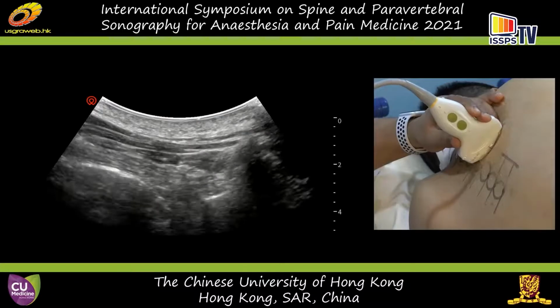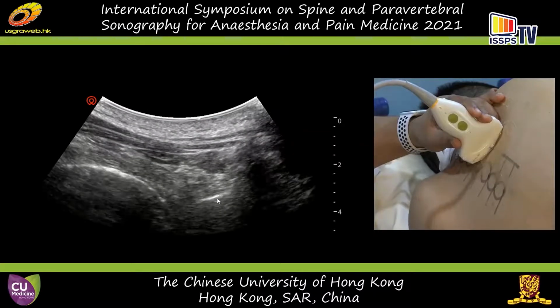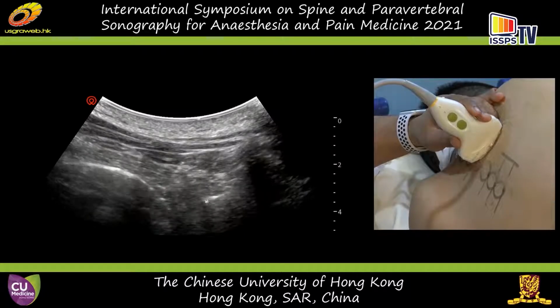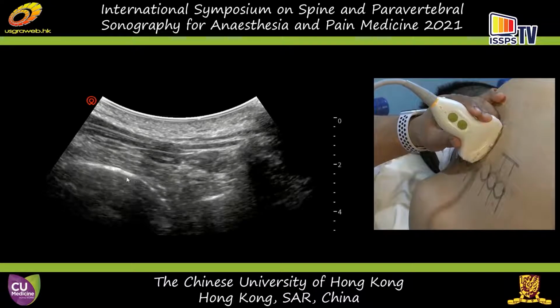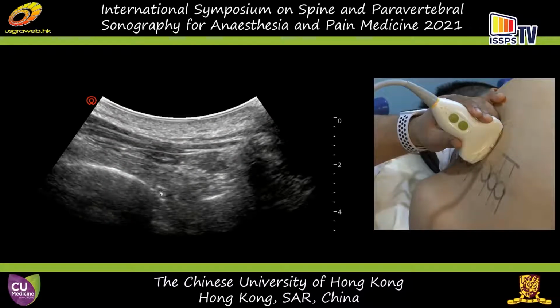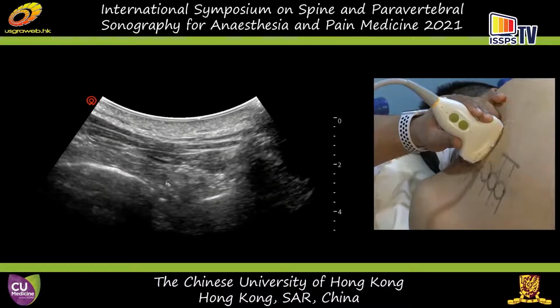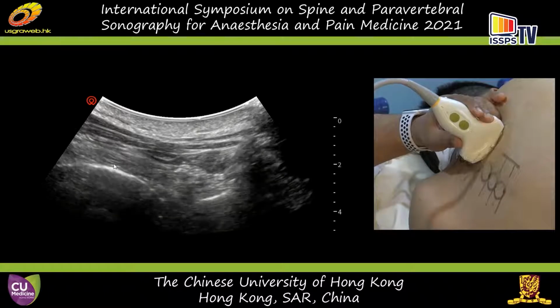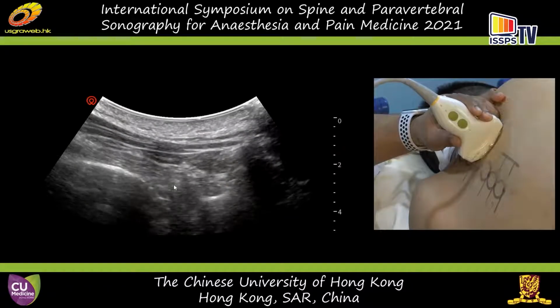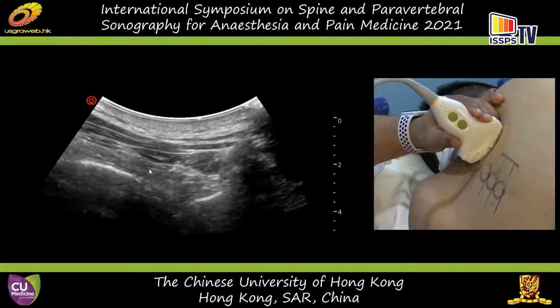Okay, that's good. So now you can see the articular process. This is that bright structure here. And then you can see the pleura laterally, and the anteromedial reflection of the pleura, you can see part of the reflection there. And then the ligament complex posteriorly, which continues laterally as the internal intercostal membrane. So this thick ligament complex posteriorly is the superior costotransverse ligament, intertransverse ligament complex.